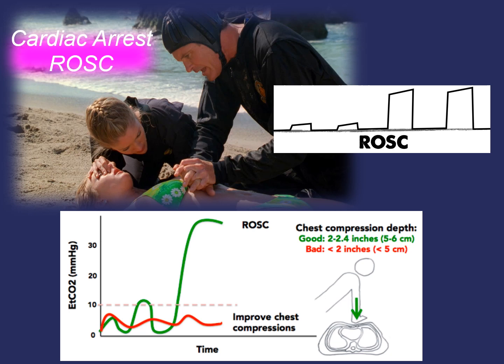So, ROSC, return of spontaneous circulation. How do we get there, but how do we stay there? You guessed it, we talked about it. Good, high-quality chest compressions. During a resuscitation, you notice that there is a sudden spike in the end-tidal CO2 value.